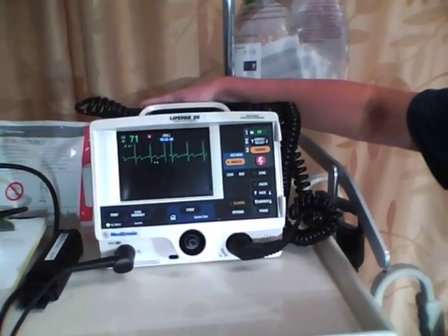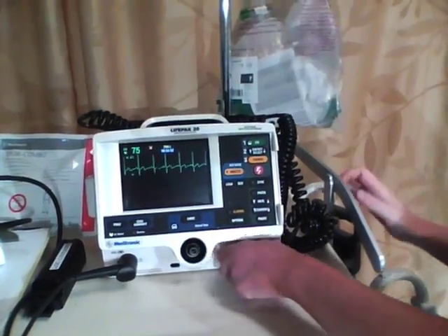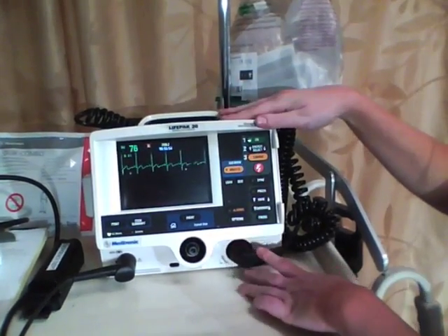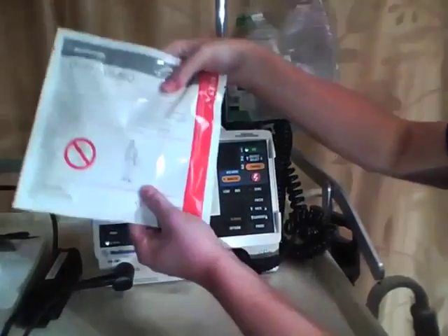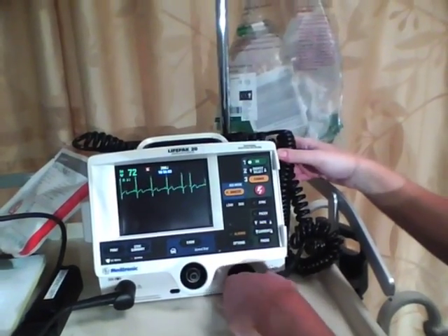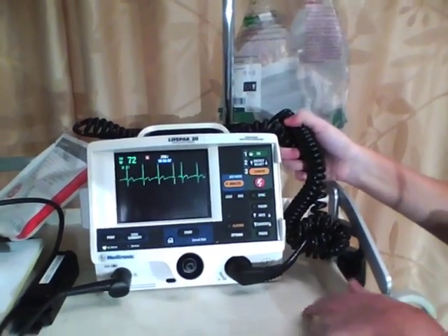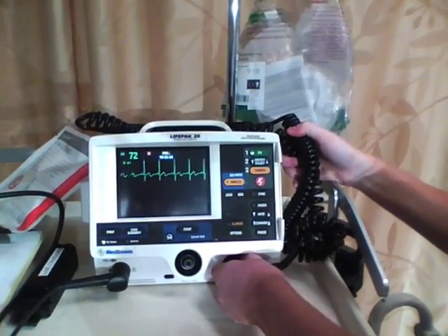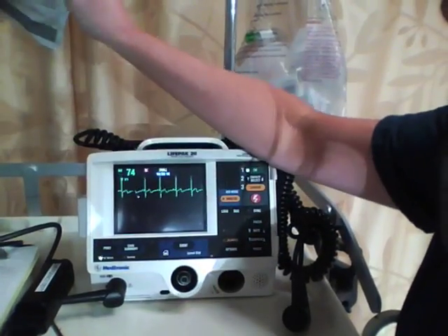These are our paddles — not the hands-free ones, but the ones hooked up to the monitor with this cord. So if you're going to do a procedure where you want to use the hands-free paddles, which are the sticky paddles that stick on the chest, you would have to disconnect this cord. You twist it to the left first — there's an arrow down there — and pull it out. Then we have a separate cord for the sticky pads.